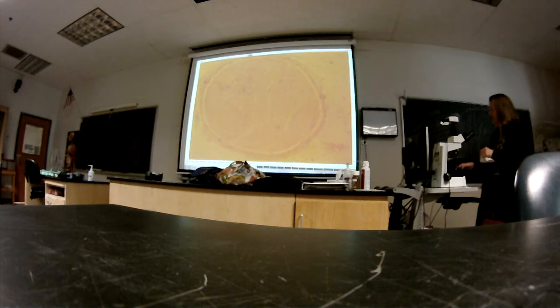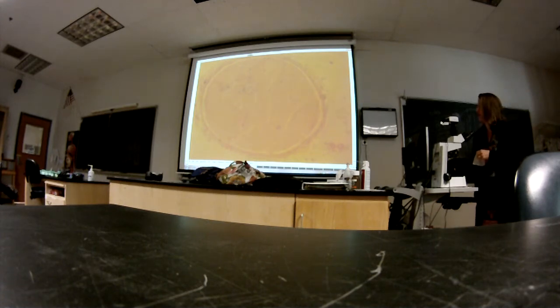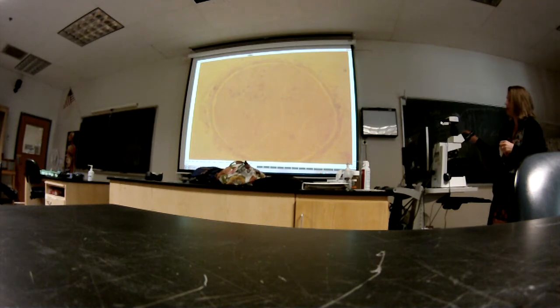So when we're looking at the nerve, first is the bundle of axons. Good, the bundle of axons. And they're bound with three layers of tissues wrapping them together, just like with muscles. They have the same prefixes: epi, peri, and endo. See that? Around this is the thickest layer, dense irregular, wrapped around the nerve, protective.